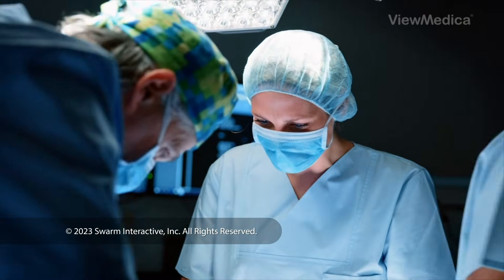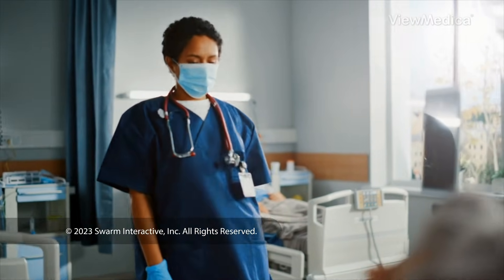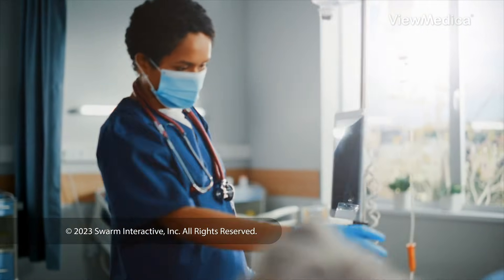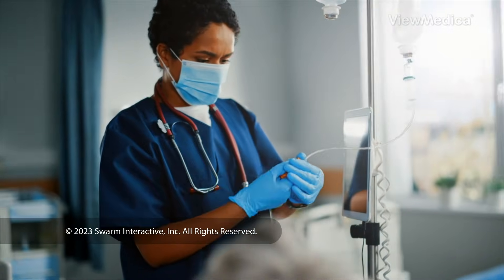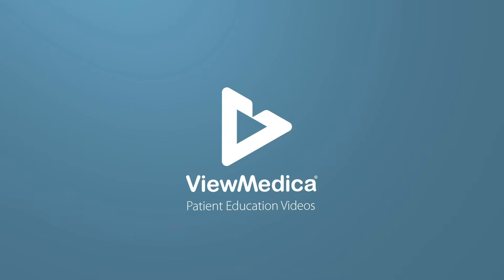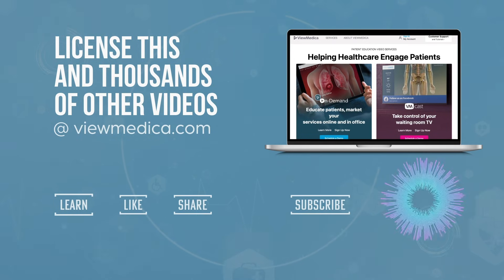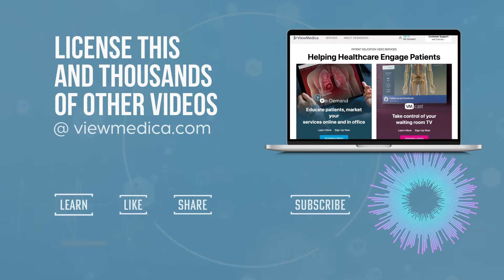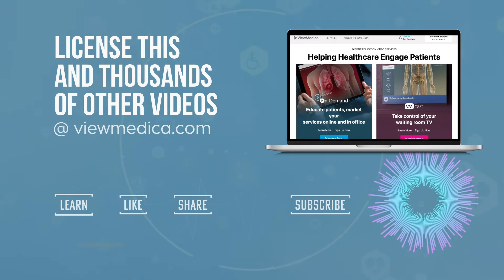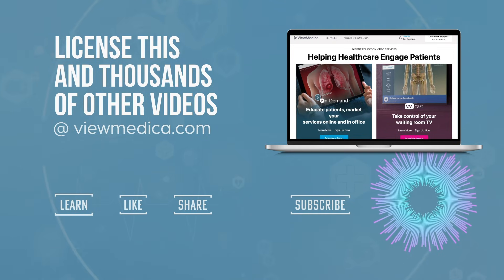When the surgery is done, we close and bandage your incision. We watch you as you wake up. Follow your care plan for a safe recovery.